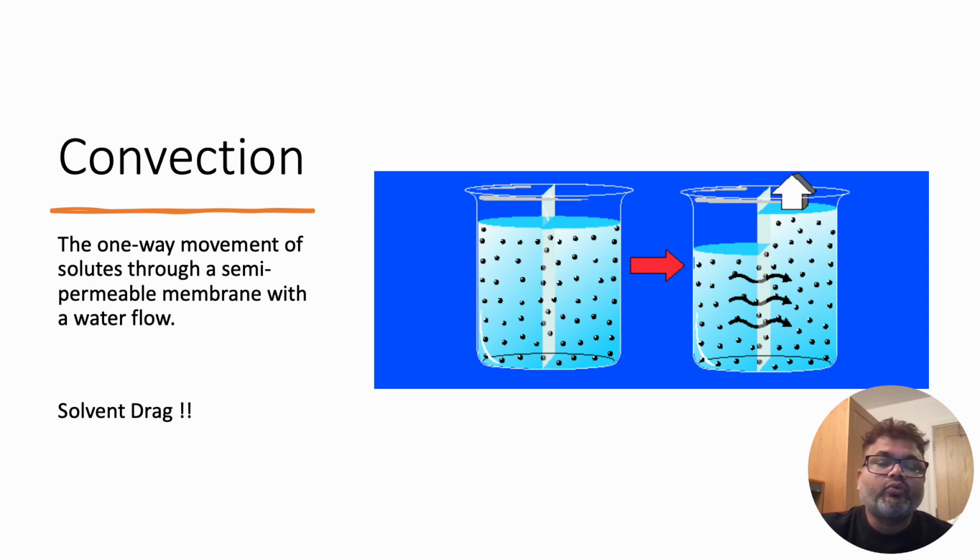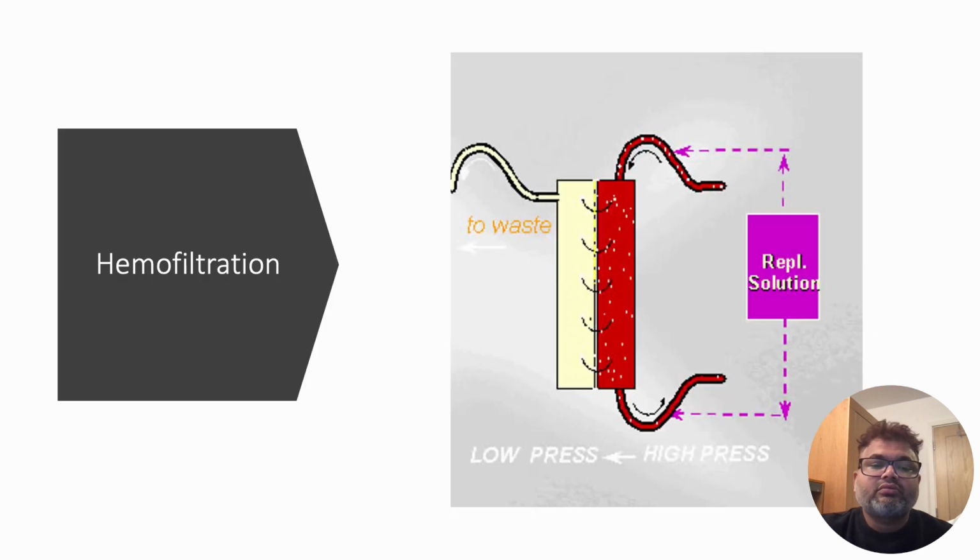So what we are doing in the machine by this method is giving some extra fluid, mixing it with the blood, and then pushing the diluted blood to the blood chamber with the pump.